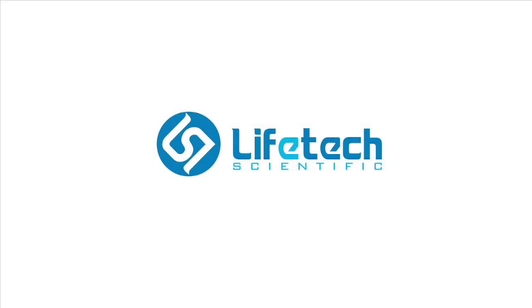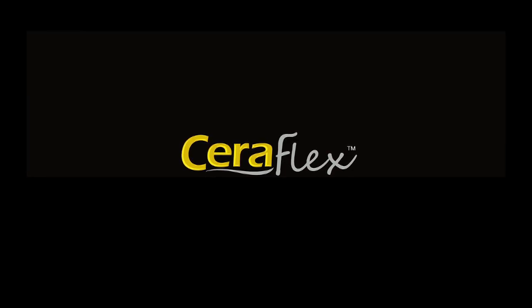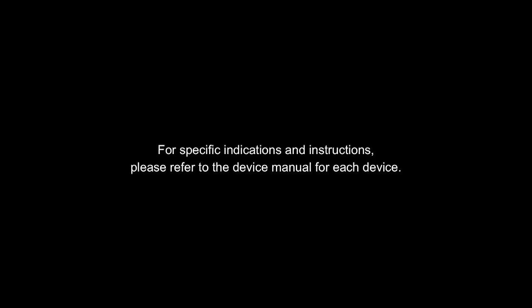The CeraFlex Closure System from Lifetech Scientific is an innovative pre-mounted device. This movie provides information on the CeraFlex Occluder and SteerEase delivery system, including components, preparation, as well as CeraFlex ASD placement. For specific indications and instructions, please refer to the device manual for each device.